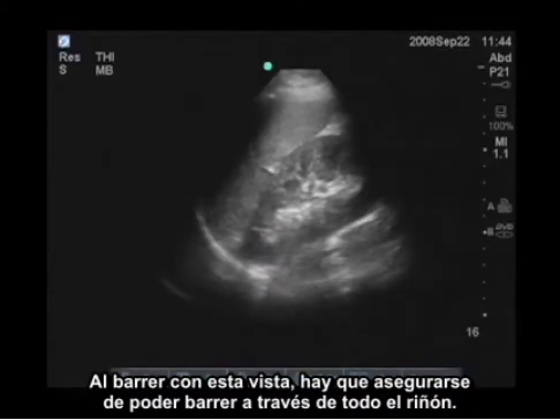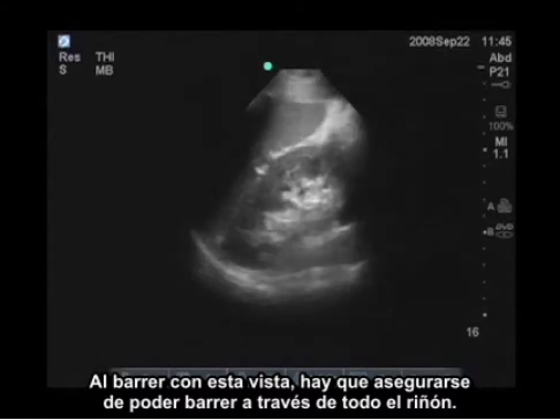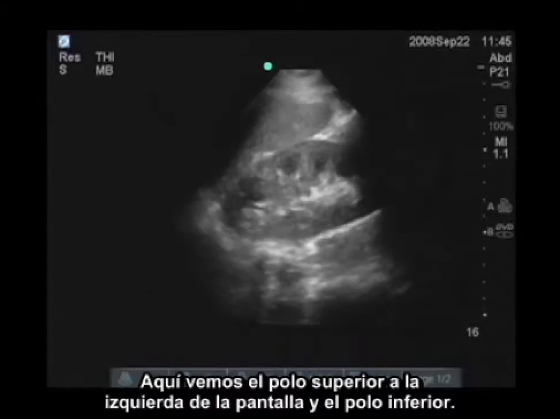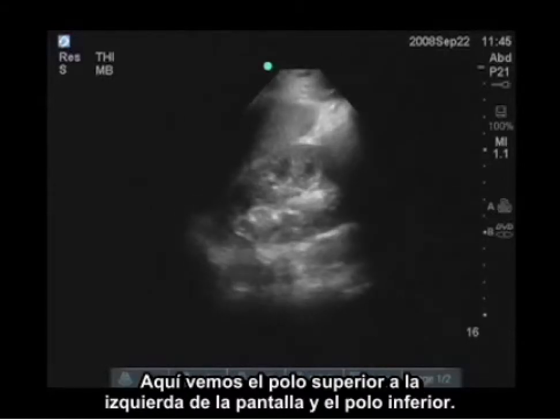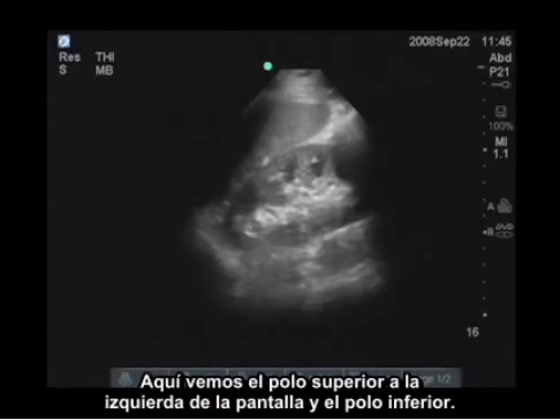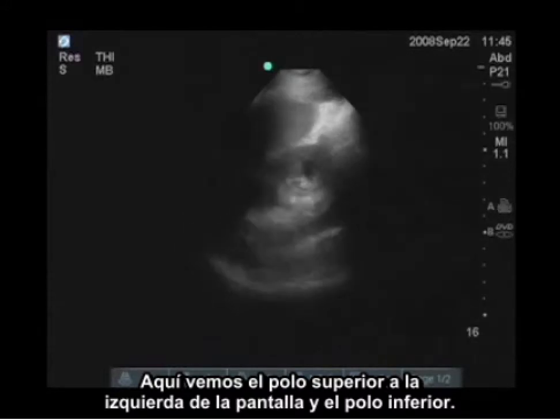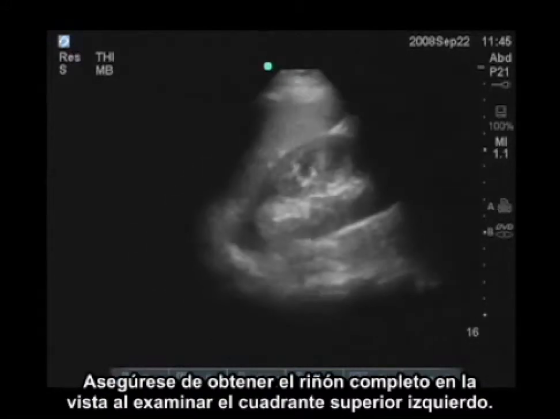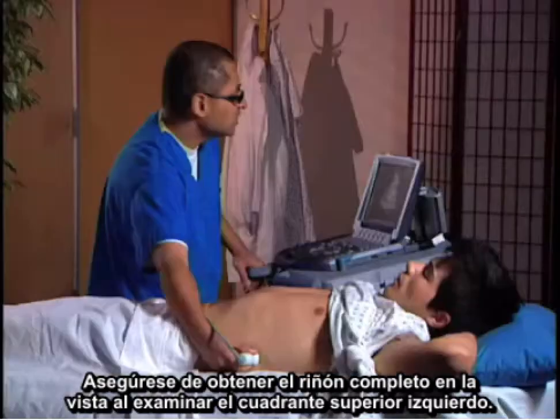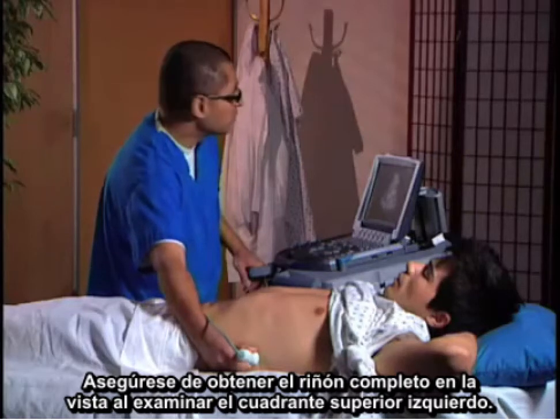When scanning in this view, also make sure you scan the full kidney. Here we see the superior pole to the left of the screen and the inferior pole — you want to make sure you get that full kidney in view when you examine the left upper quadrant.